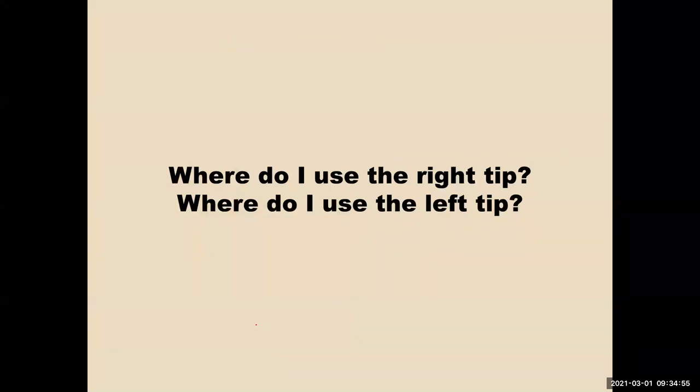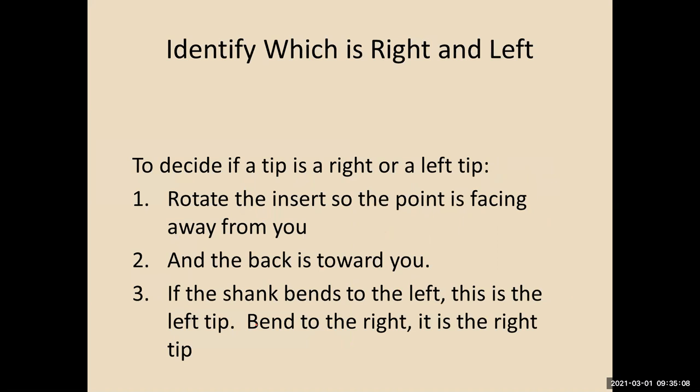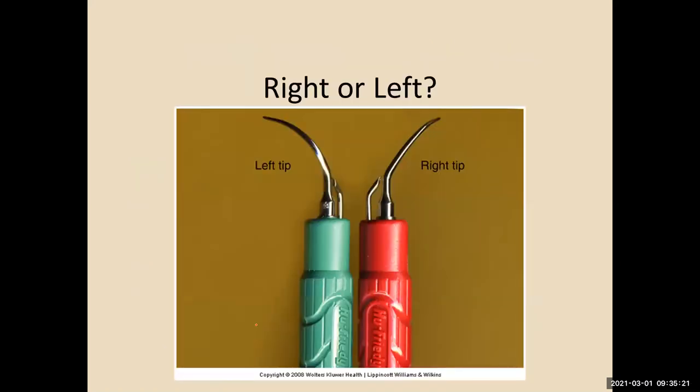Where do I use the right tip? Where do I use the left tip? They're called right and left. Yours are not color coded. It doesn't refer to the areas of the mouth. If the shank bends towards the left, that's the left tip. If the shank bends towards the right, it's the right tip. That's just for identification purposes.